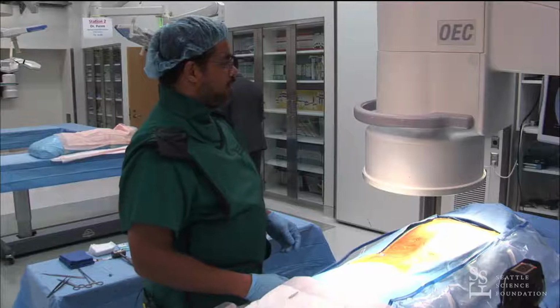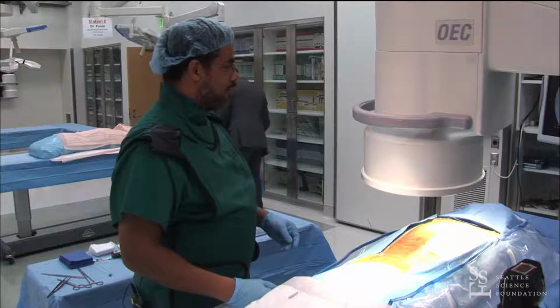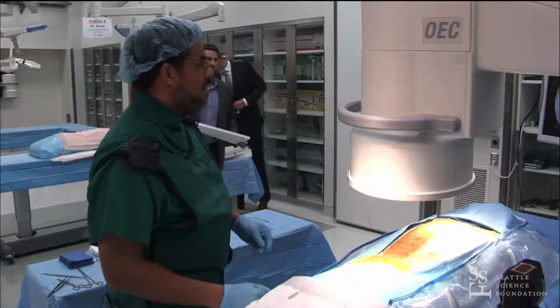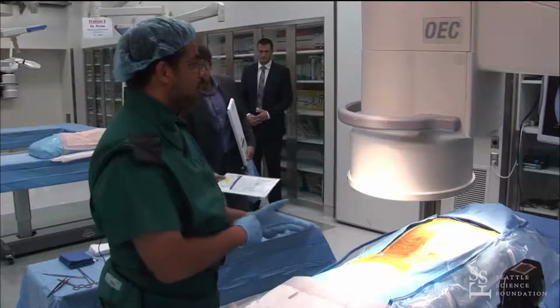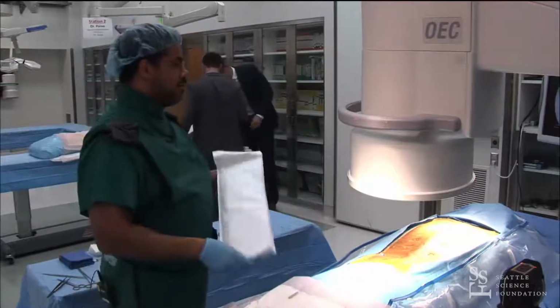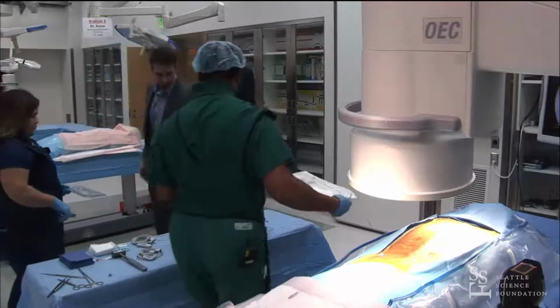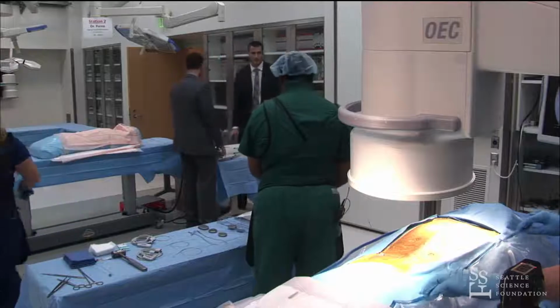So we certainly have some challenges here with spacing, but let's come further south. Lots going on with this spine, of course. Yeah, we used these spines yesterday's cadaver day for the vertebral augmentation. Great. So there's a few areas of contrast cement there. So since, where's one of your needles? Oh, here.